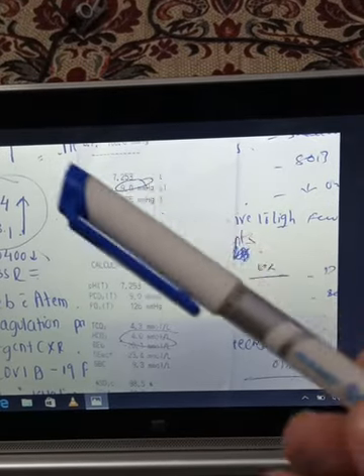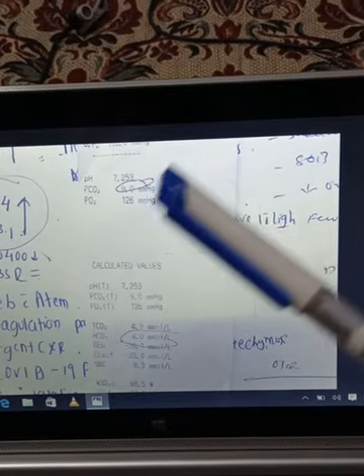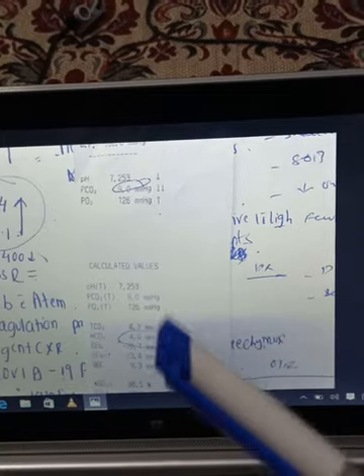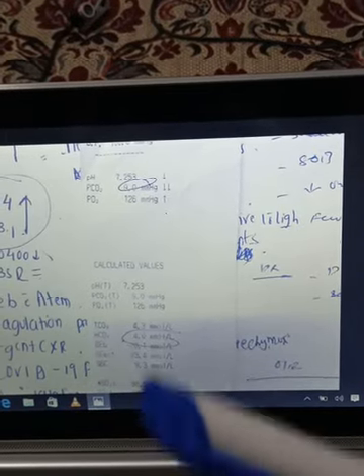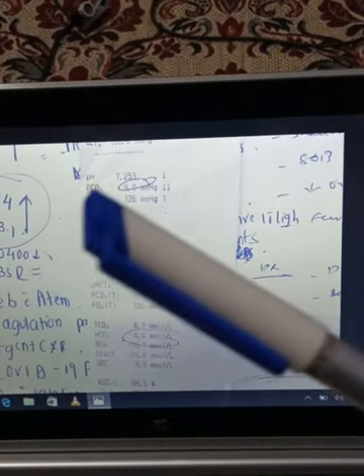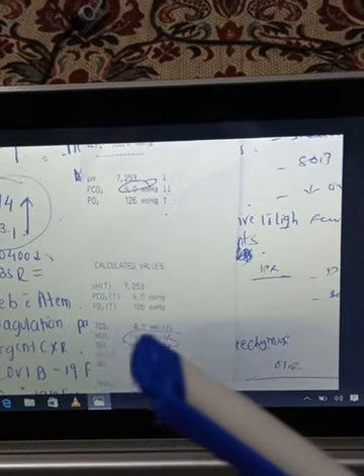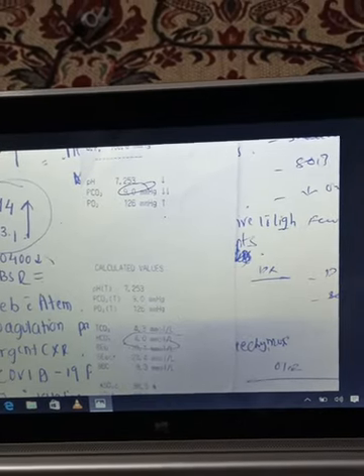The pH is acidotic. Which decrease causes acidotic pH? Decrease of CO2 causes acidosis? No, it causes alkalosis. The decrease of bicarbonate causes acidosis? Yes. The primary pathology is the decrease in bicarb. So this is metabolic acidosis.